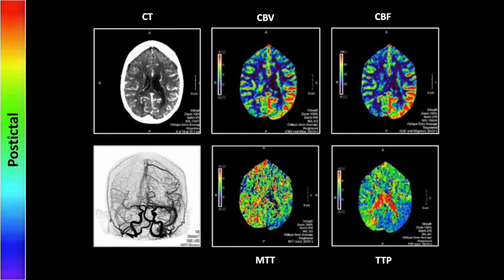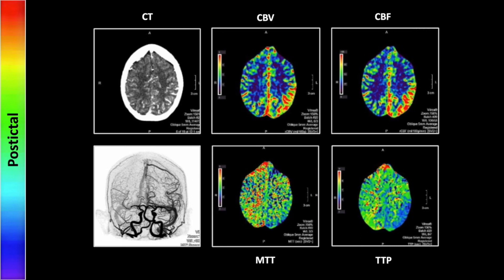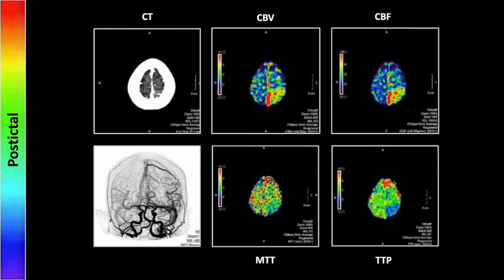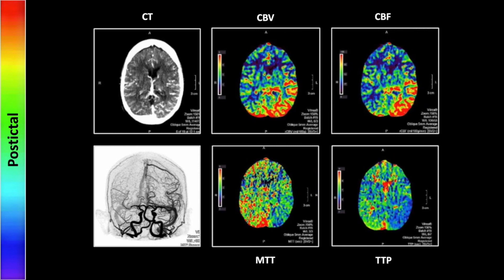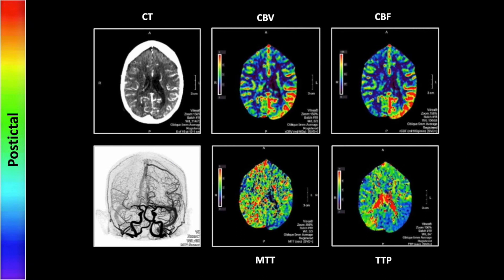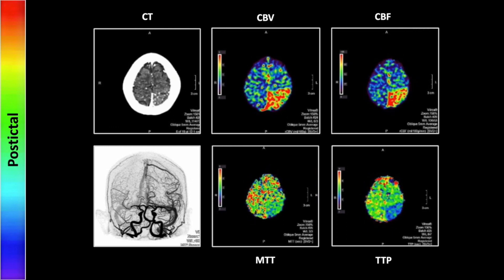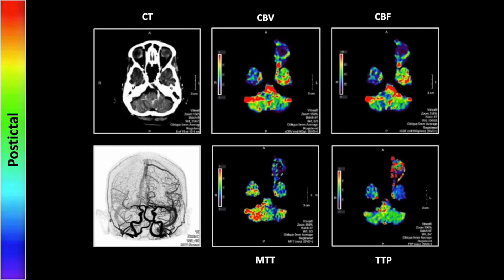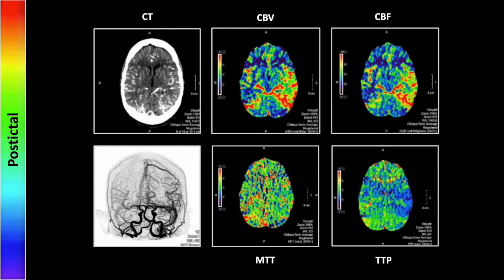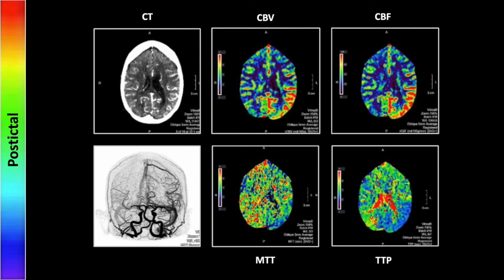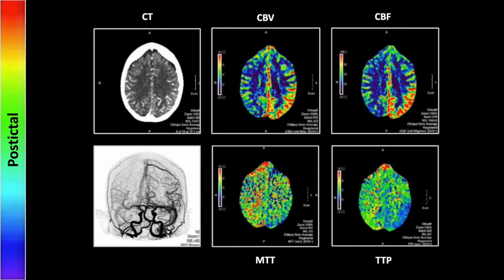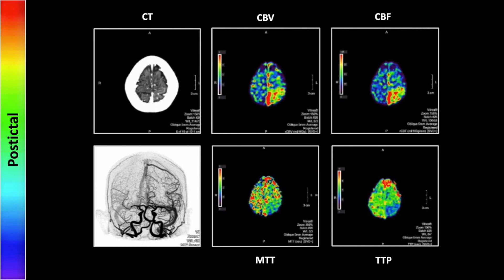Here are the cine images — again, prominent vessels with increased blood volume and blood flow in the region, then altered TTP and MTT, all of these things moving in the opposite direction one would expect for an infarct. So that is a case of a recent seizure with post-ictal perfusion changes.